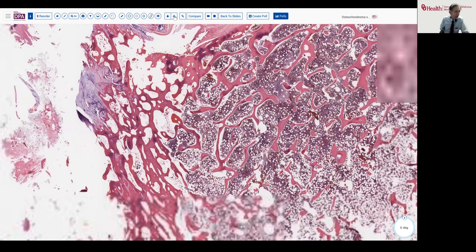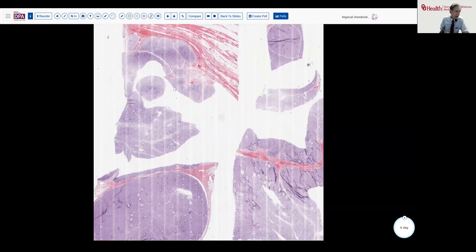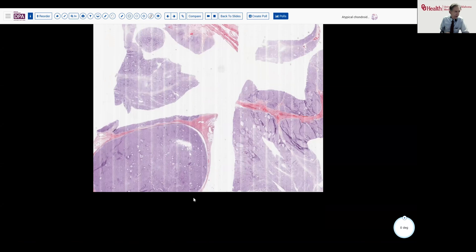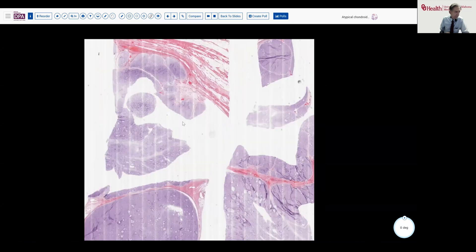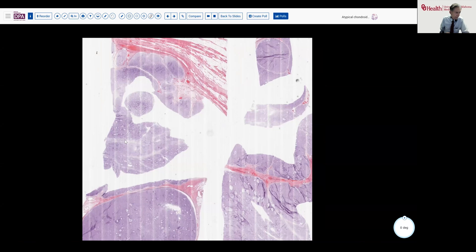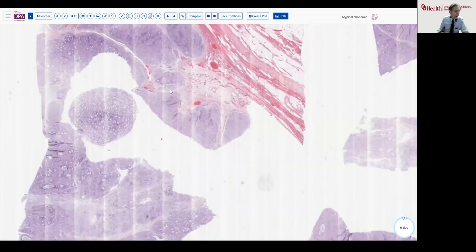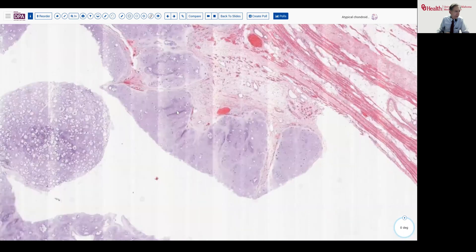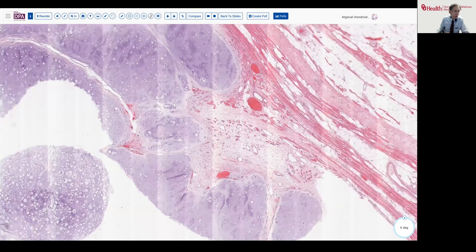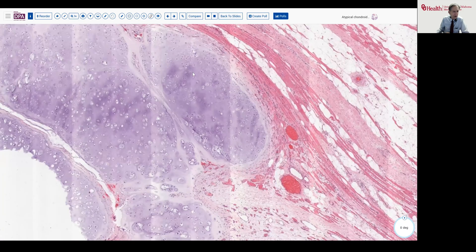Well, what does the tumor look like elsewhere? On sectioning, this was remarkably homogeneous — a very glistening type of pattern that you would expect from a cartilaginous tumor. And here, as we see under section, the same is true. We can appreciate that lobularity that we saw on the MRI scan, and as we look at this tumor, we see again a sharp margin, but some dissection into soft tissue abutting up against skeletal muscle here.